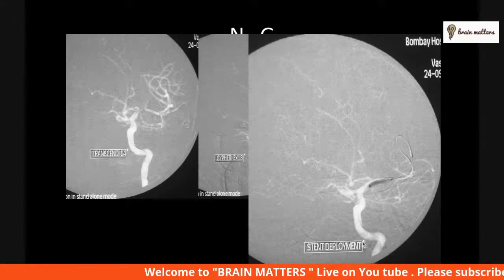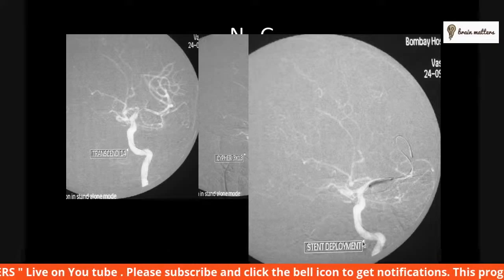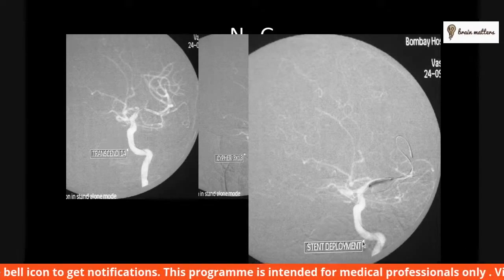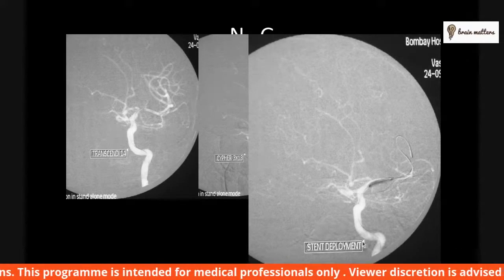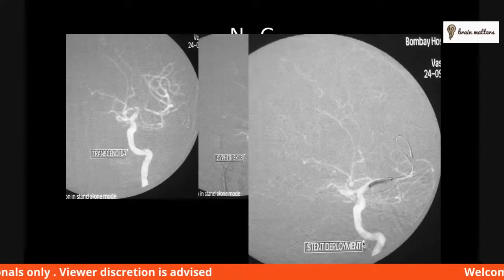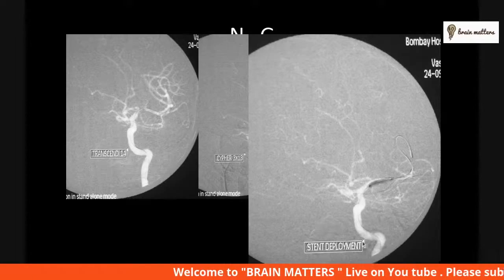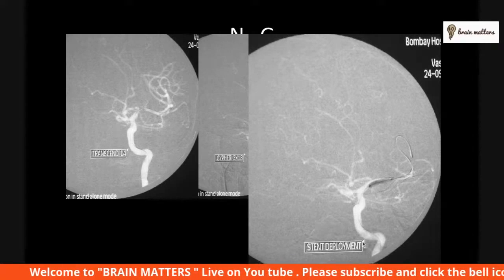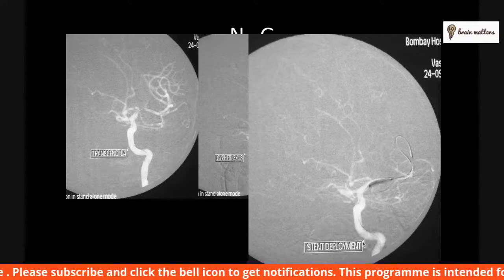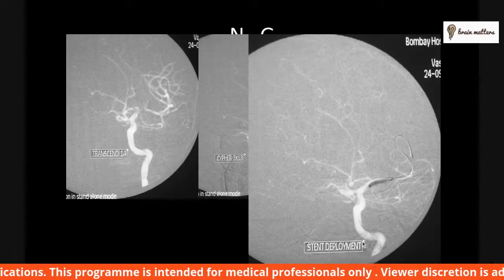I used to always prefer direct stenting without angioplasty. So we used to eyeball what the size of the artery is and use a drug-coated balloon-mounted coronary stent. We had done quite a few by then, and our impression was that the restenosis rate with a drug-coated stent is low. So we would, as far as possible, use a drug-coated stent. So this was a Cypher.